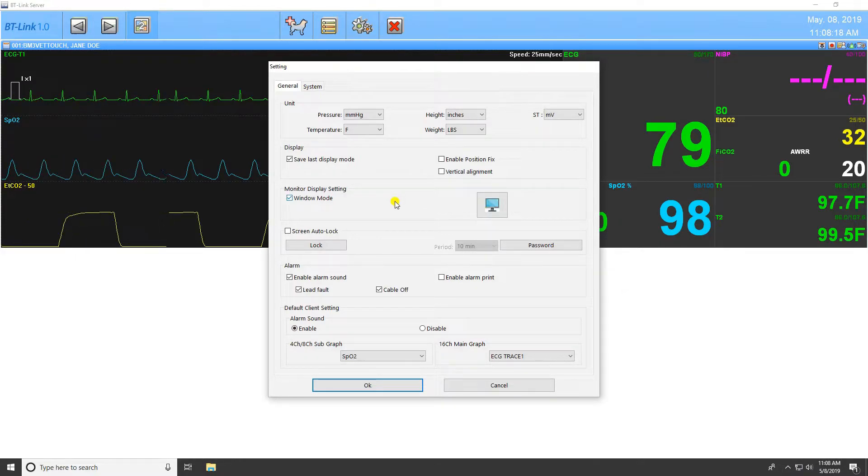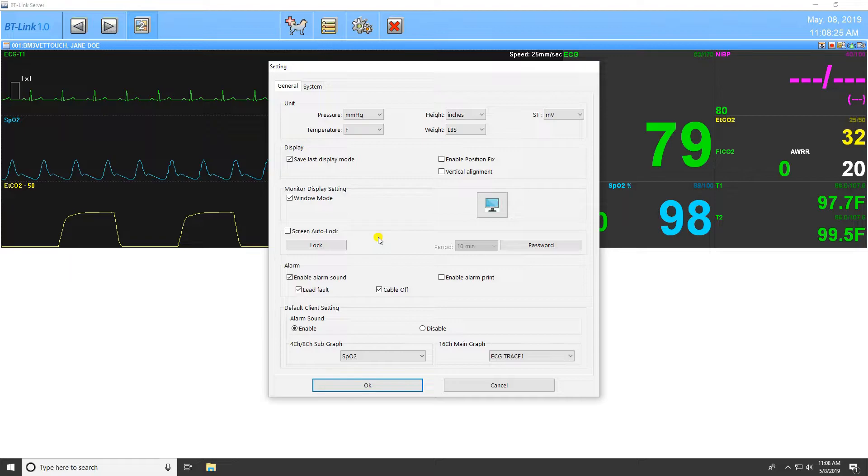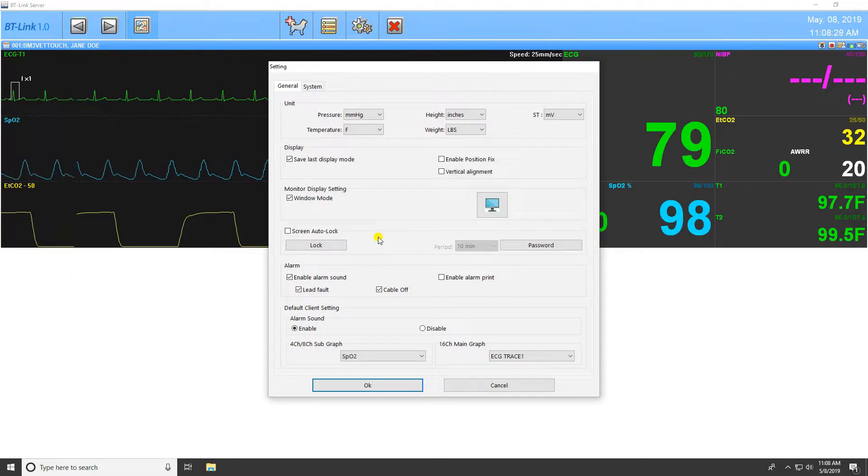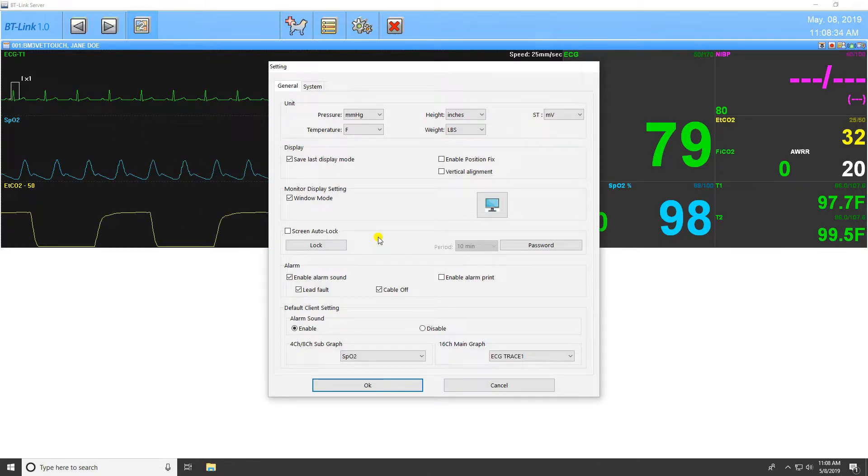The next setting is the Screen Auto Lock. This option will place a one-time lock on the screen so that changes cannot be made without a password. The Screen Lock will activate if there is no movement detected from the mouse or keyboard within the time frame set by the user. Be advised, if you wish to use this feature, you must first set up a password, as the program does not have an initial password stored.